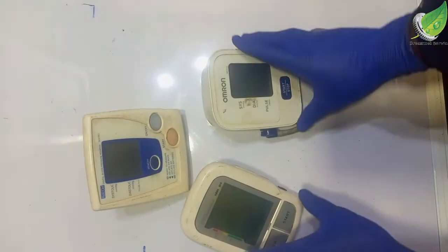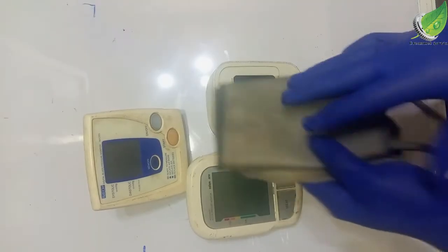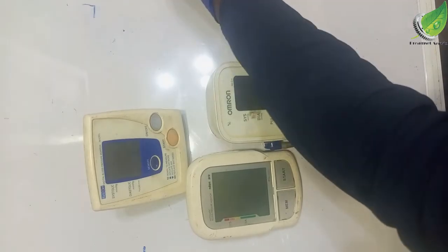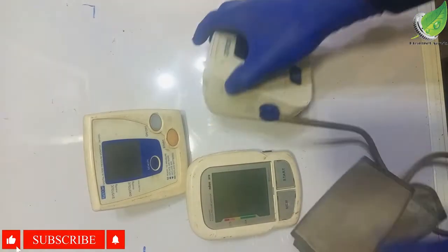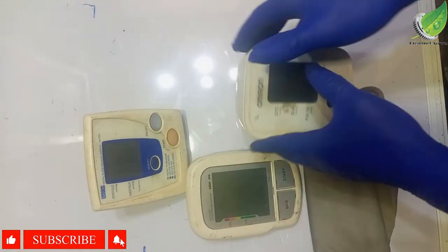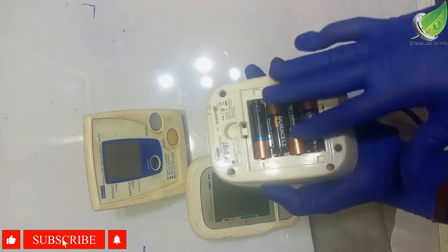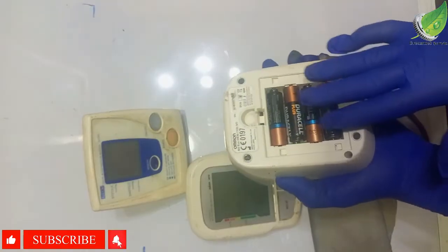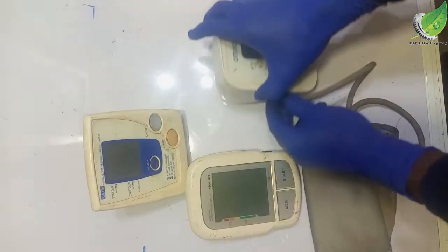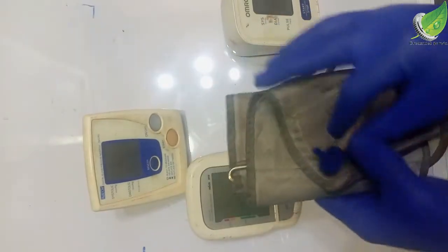So if after trying all of this, you've checked your cuff is okay, it's properly positioned on the hand this way and it's not loose, and this pipe also is properly plugged in and it is not loose, your batteries are okay, none of them is bad, they're all good and have enough charge in them, you might want to consider replacing the cuff.